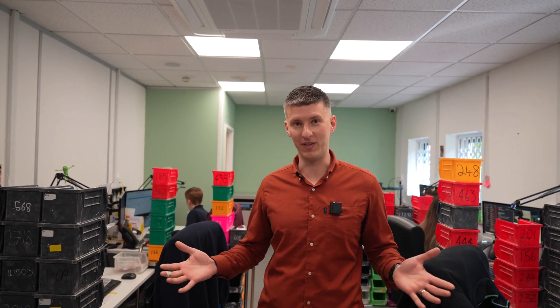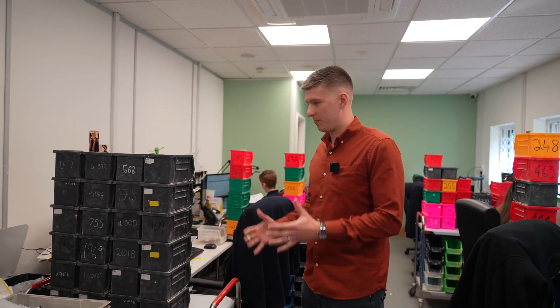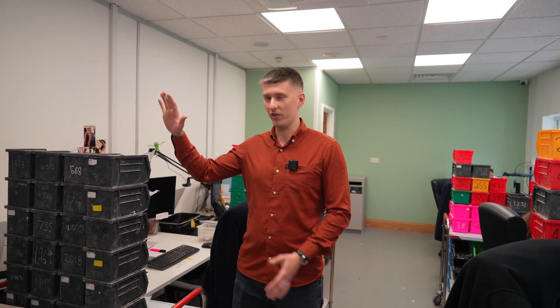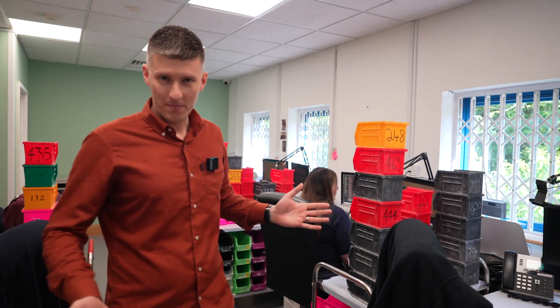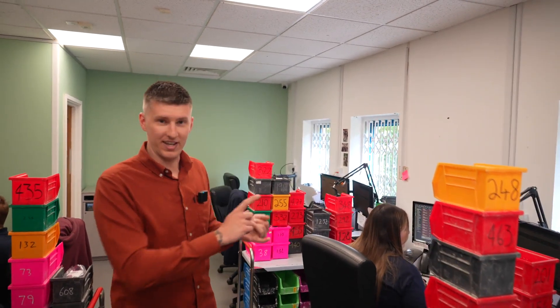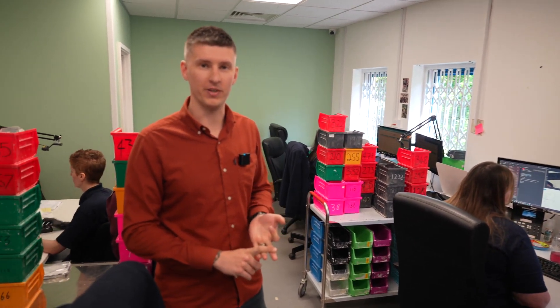This is where the journey begins at S4S. Work arrives in the lab, whether that's through postage bags, parcels, or digital scans, and we essentially allocate it to a coloured box depending on the kind of work it is — bleaching trays in grey boxes, retainers in reds, and so on. We then use our system to allocate which tasks need to be done, who needs to do them, and when they need to be completed.